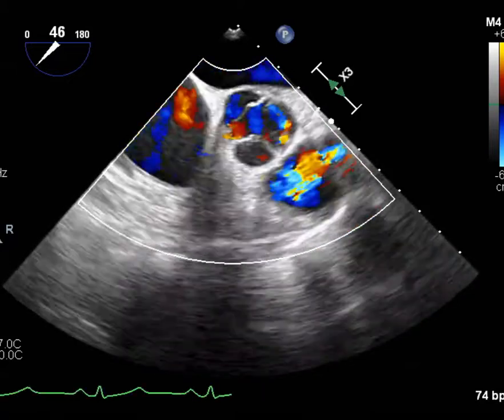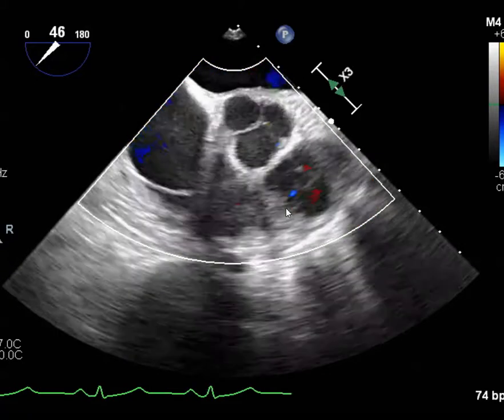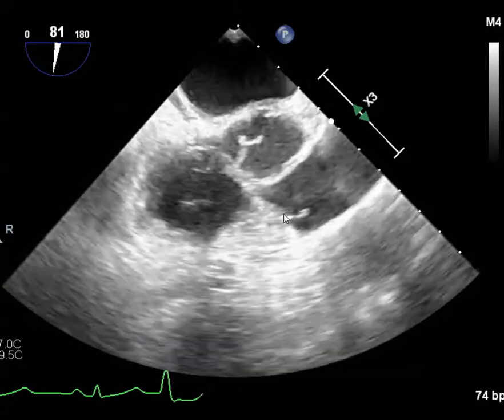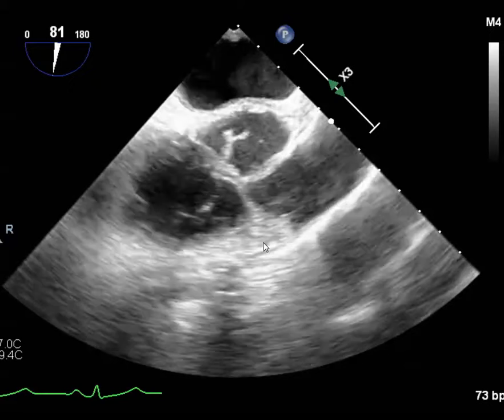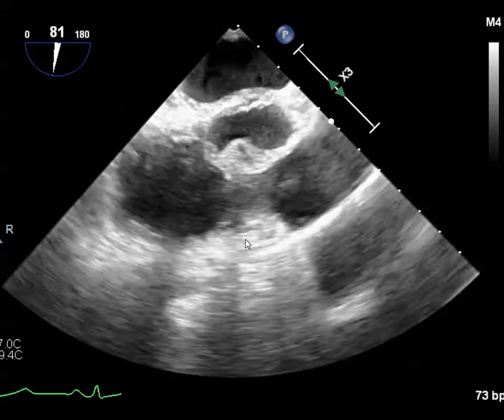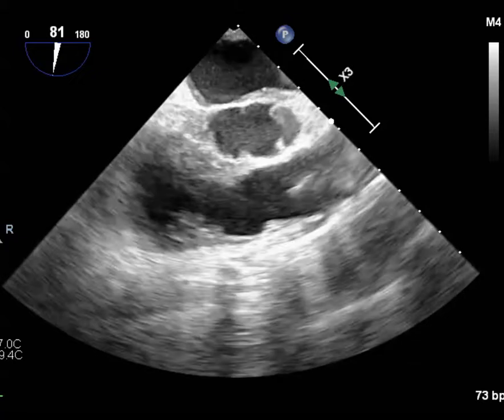So initially the problem is that here in the short axis view we have our pulmonic valve, and we can probably measure it pretty well, and I did so here. I'll show you the measurements a little bit later. So pretty good. We can at least measure the RVOT right under here at the pulmonic valve. But the problem is, how am I going to Doppler that? We're completely off axis.